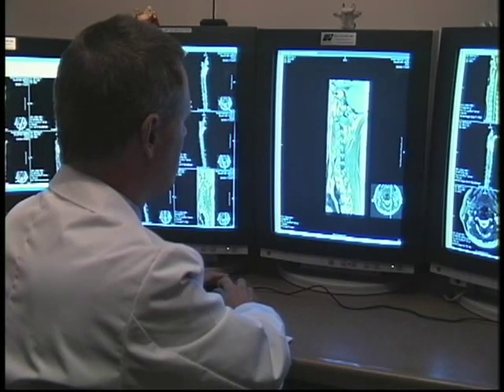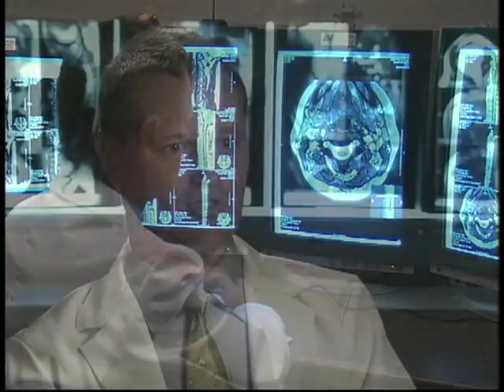The reason that you don't see MRIs in urgent care centers and most emergency rooms and most general practitioners' offices is it's a very expensive modality. The overhead is very high. These scanners cost on the order of $1.5 to $2 million. And that doesn't even include the siting and the operational expenses that are associated with it. So it's relatively expensive technology, but when it's placed in a center that doctors can refer to from a relatively large area, it can provide care to a large catchment population.